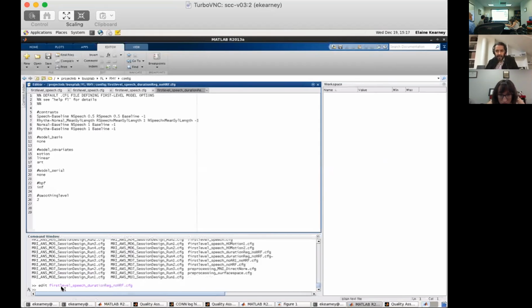So, what type of sparse sampling was it? How far apart are the acquisitions? Are they always the same distance or not? For mine, they're all 11.5 seconds between acquisitions. So it sounds like that's okay.